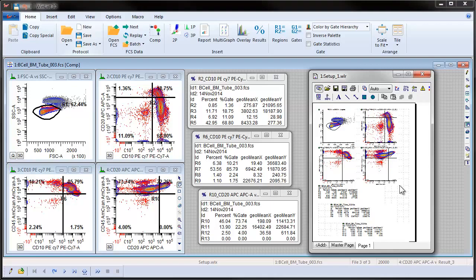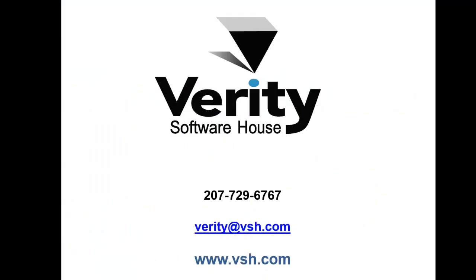We created a new report and dragged the elements we wanted onto the report and processed a batch of files through the analysis setup, and then saved the protocol.